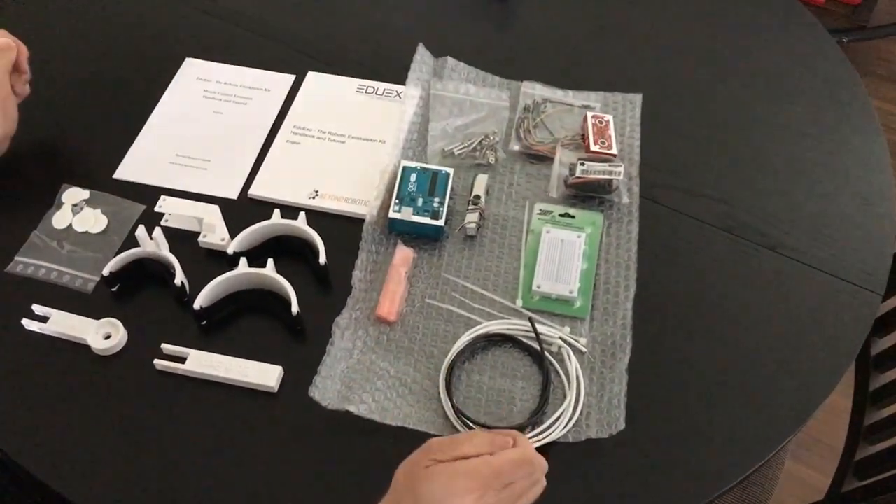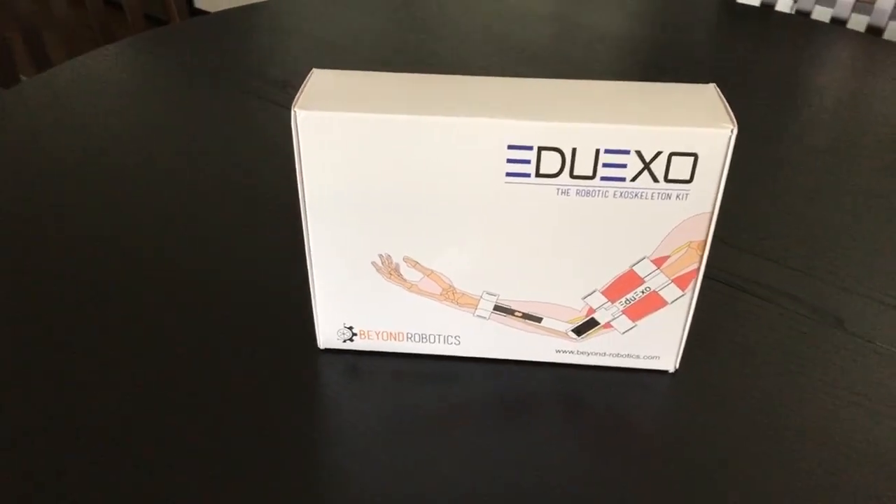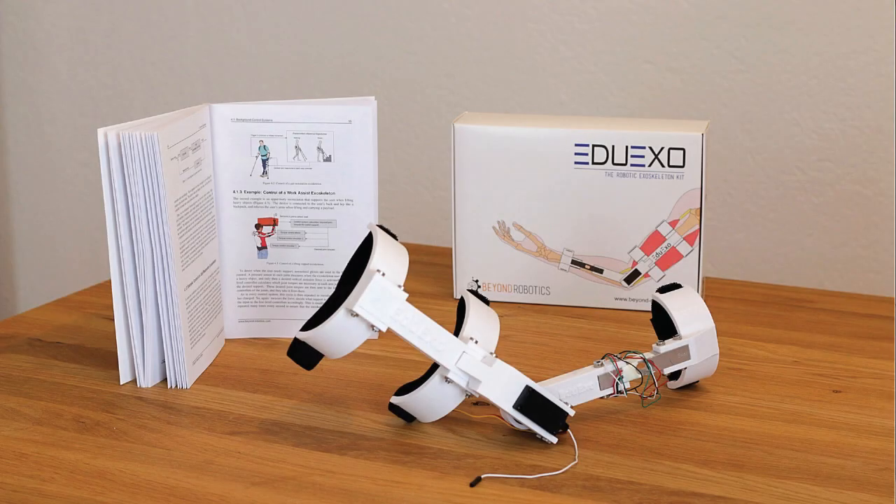So with this, once again, you can lead the class or you can use this for your own personal education. This is the EduExo STEM kit.